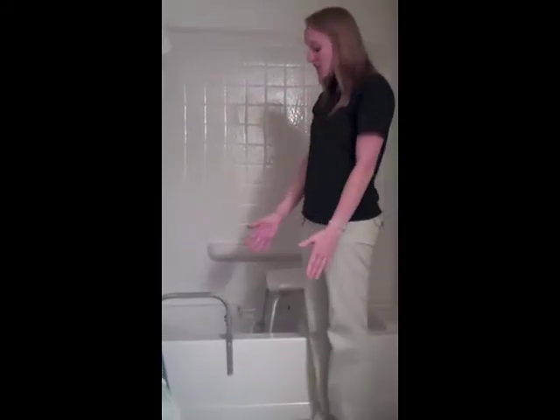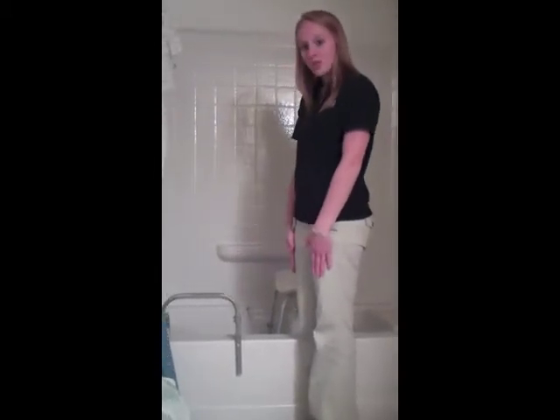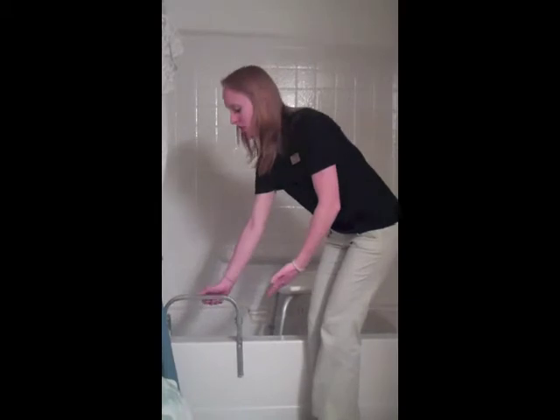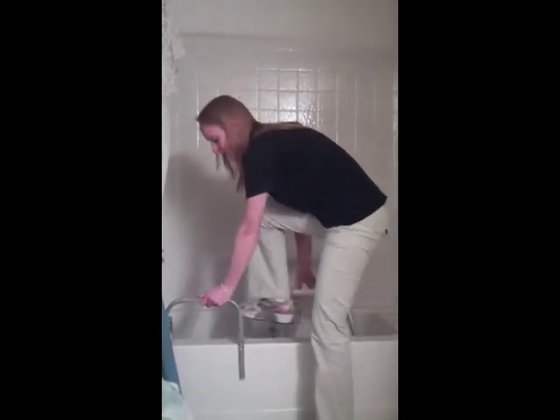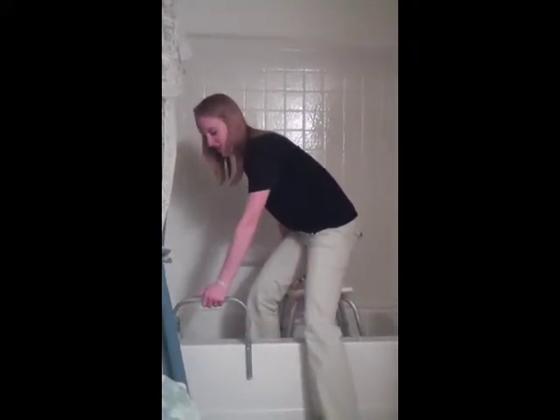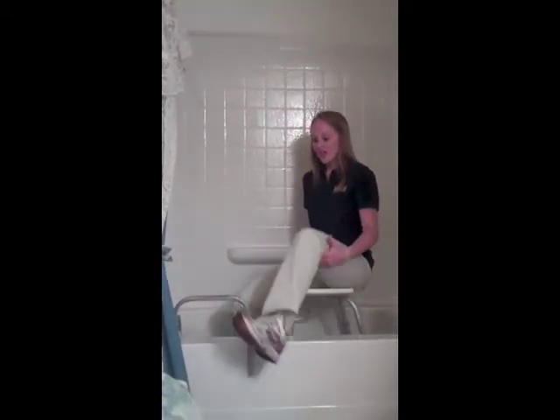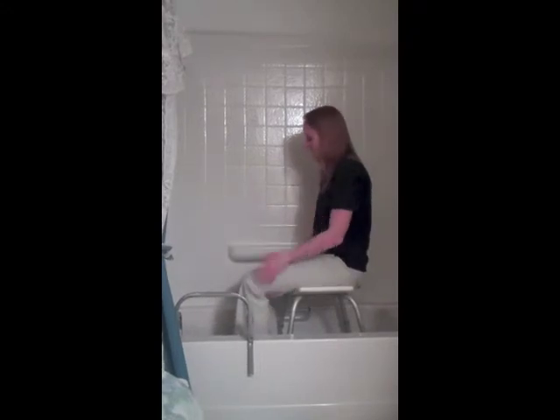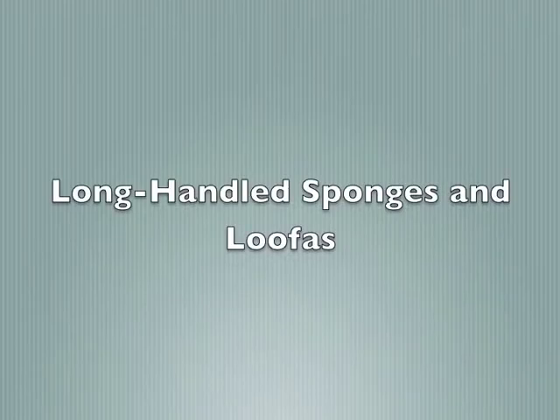When getting into the shower, you always want to try to lead with your strong leg first if you have an injured extremity. And sometimes that's not always possible. But if it is, if you're leading with your strong leg, you can always brace yourself with a grab bar. So you brace yourself with a grab bar, put your good leg in first, trying to put as much pressure through your arms and things to take weight off of your bad leg. And then it's sometimes easy to sit down and aid your other leg into the shower, like so. It can also be helpful if you have grab bars up here to hold on to while doing this.